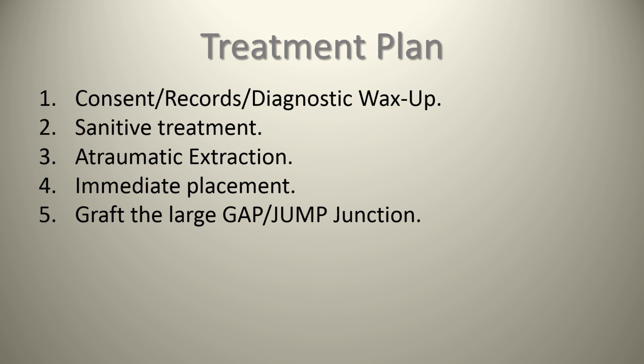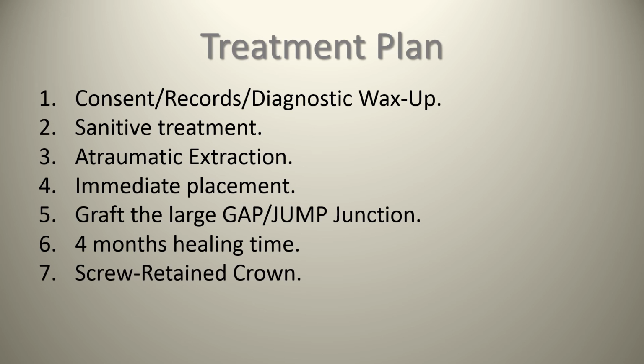Or in this particular case, I think we used a collagen plug for the patient because she was a bit needle averse, and she didn't want us to venipuncture her to harvest her blood in order to create the platelet-rich fibrin, and then give her an adequate amount of healing time. So in this case, we gave her about 4 months of healing time, and then basically provided her with a screw retained crown, and then as always, a bite plate and some sort of a follow-up for this patient.